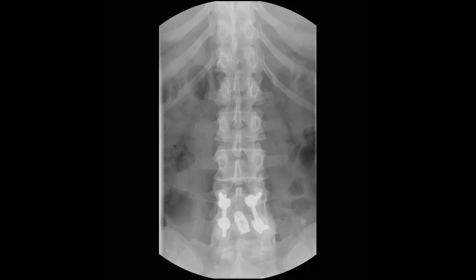The patient I'm presenting here is actually a myelogram. I'm using this case to demonstrate the technique for a lumbar puncture. The post-injection images that we'll get at the end will help you understand the thecal sac in relation to the bony landmarks. This is a PA shot of the lumbar spine with the patient prone.